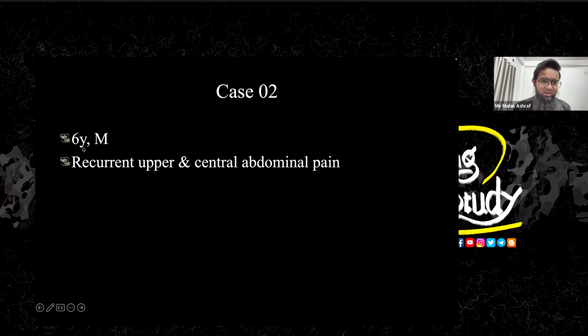So this is a 6-year-old male patient, okay? So there is a history of recurrent upper and central abdominal pain, which is common for this age kids. So let's see what we have got on ultrasound.